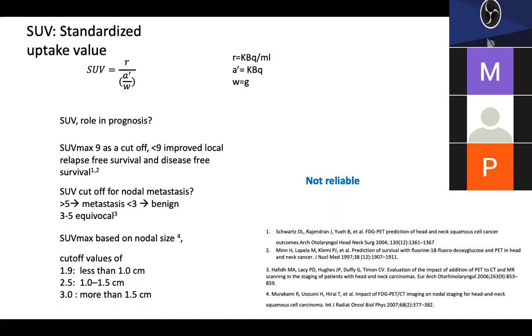And we are doing a PET CECT. Some of the studies even did a non-contrast CT with the PET. They compared CECT with a non-contrast PET-CT. Still, PET performed better than CECT in picking up some of the nodal mets. They do say that small volume nodes might not be picked up in PET. That is true. However, if we have a CECT, that problem doesn't happen, because many of the papers that conclude this were done in an era when they mostly did CT without contrast in conjunction with PET. A small necrotic node might not be very avid, but we will obviously call it a met.